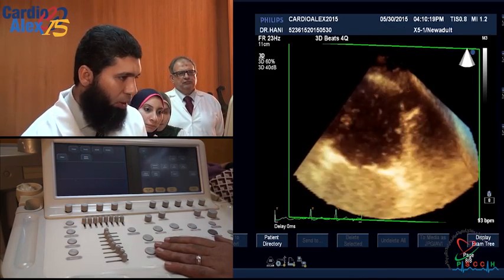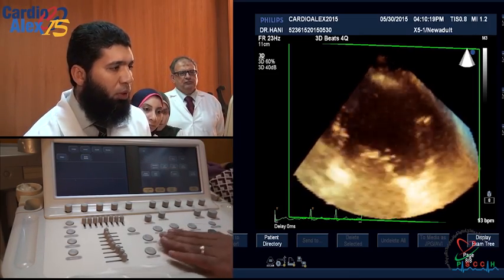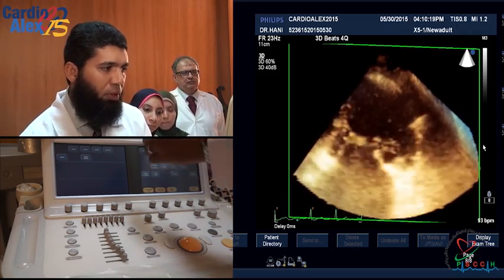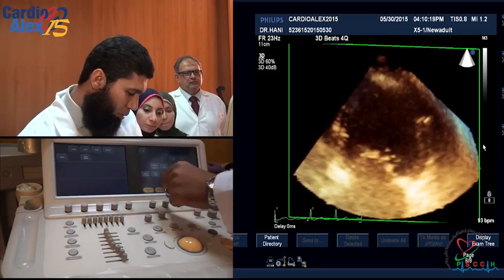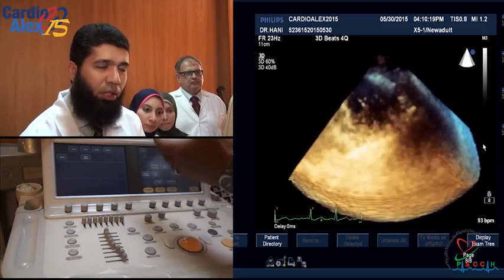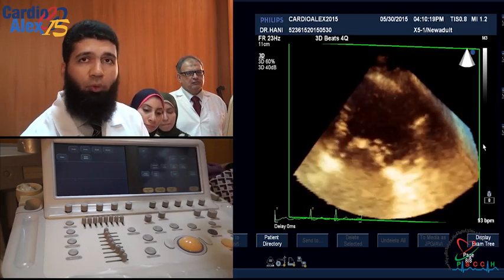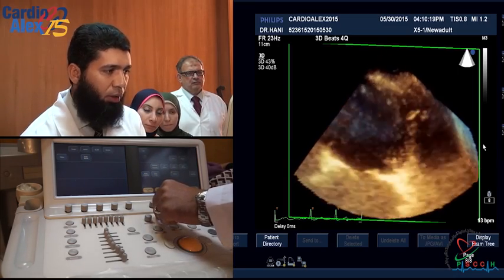This is the volume I got. Once you ask the machine to show you the full volume, it will show you the full volume with a green plane, as you can see. That means this volume is cropped. It means it showed you the inner half of that volume. Then you can reset cropping to see the full volume. This is the real shape of the full volume, but the machine will show it to you cut in half to show you what was inside, and then you can work with that later on.